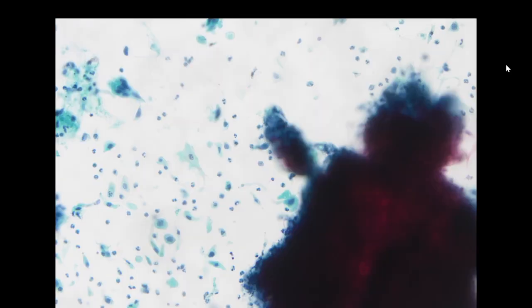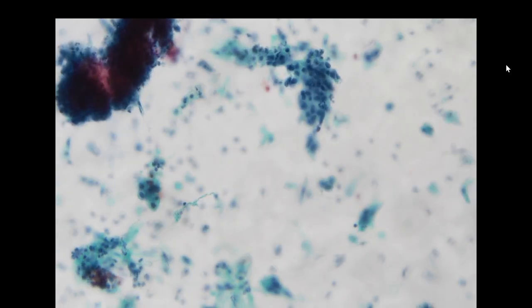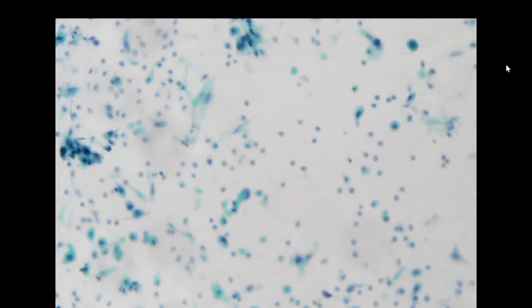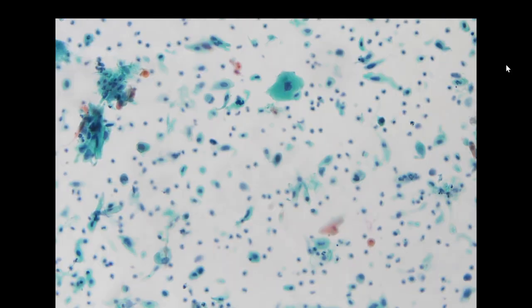For this case, because he already has been diagnosed by biopsy, they have performed it on the biopsy specimen of the primary lesion, which is negative for p16. So this is likely HPV-negative squamous cell carcinoma. We would just call this squamous cell carcinoma, compatible with metastasis. There is rarely a primary squamous cell carcinoma here.